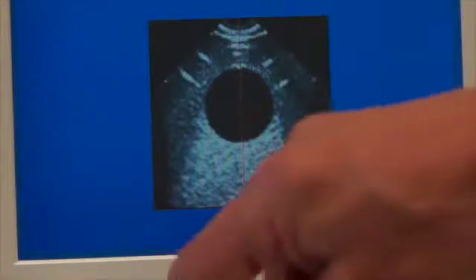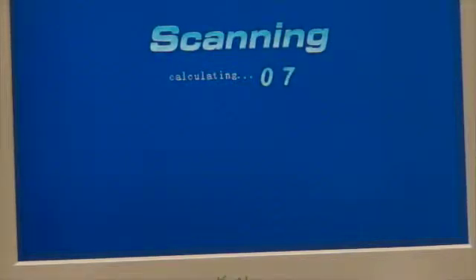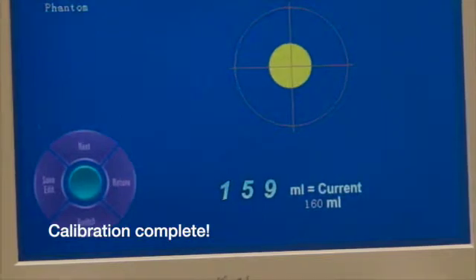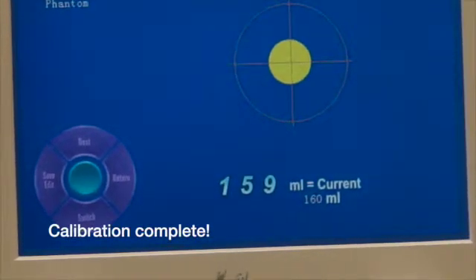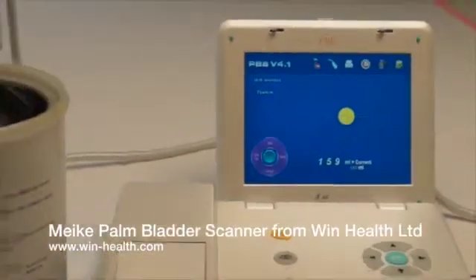Just one final check to make sure the calibration is correct. That's perfect.